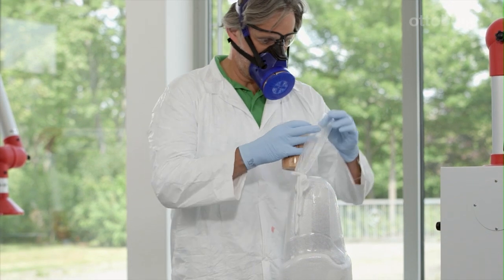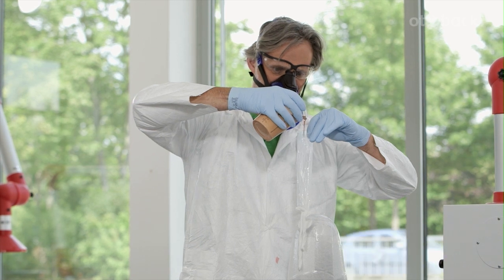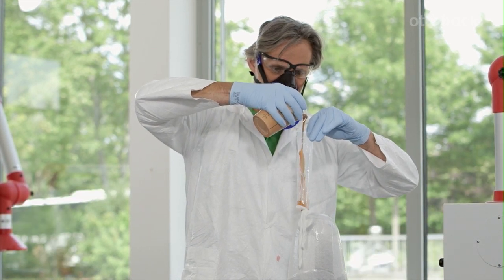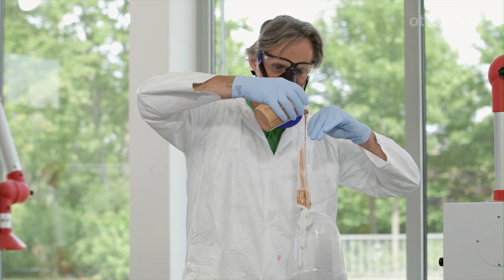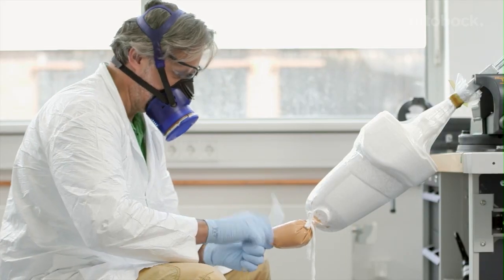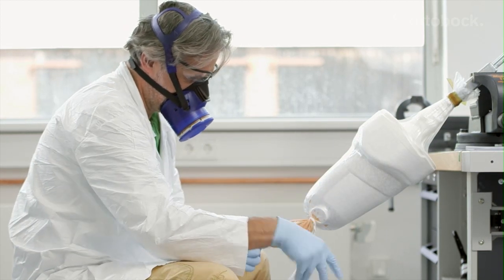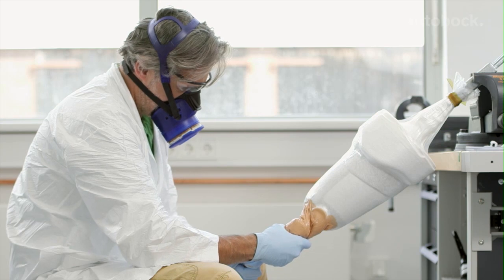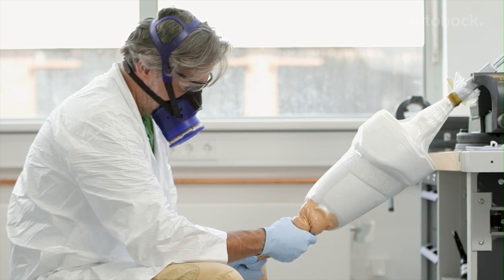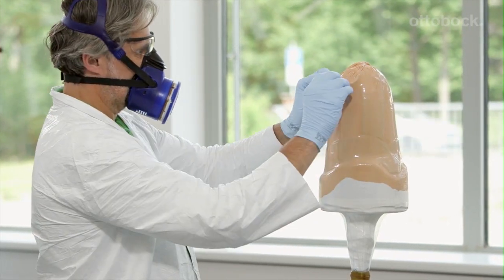The lamination process can begin. Here, you need to have a feel for the process. Laminating the socket works best when the resin is absorbed by the reinforcement gradually. This allows the 8020 Pro to displace the remaining air most effectively. By carefully working it in, I ensure that any air bubbles escape, and I obtain a component with a low proportion of resin. The old rule of thumb applies: the less air remains trapped in the resin, the stronger the component will be.